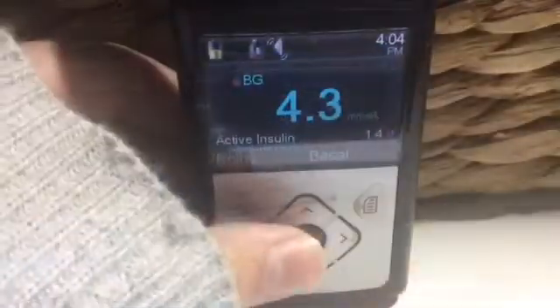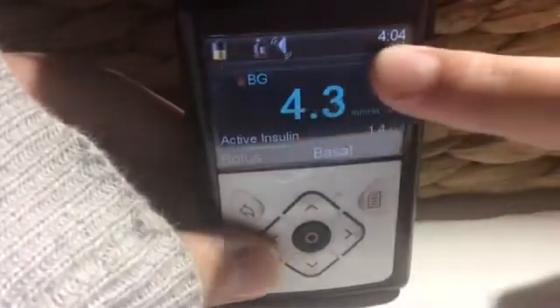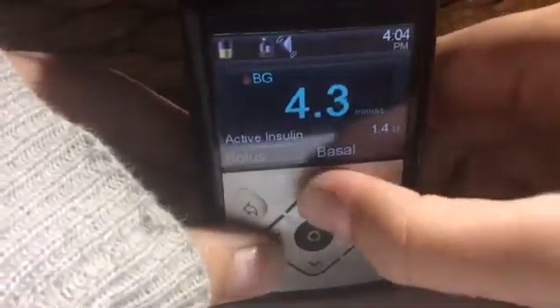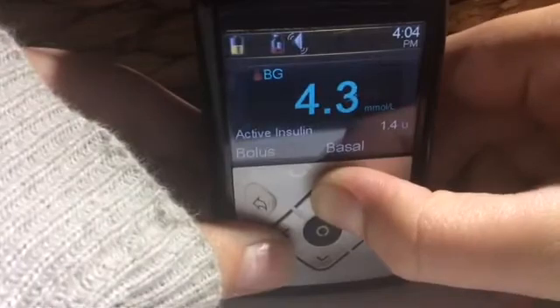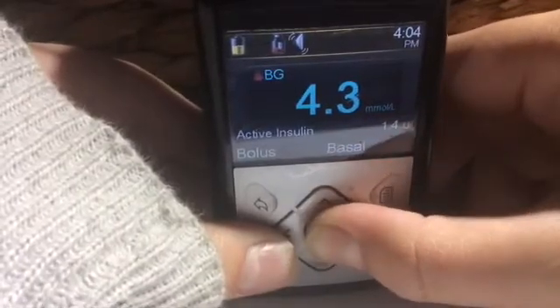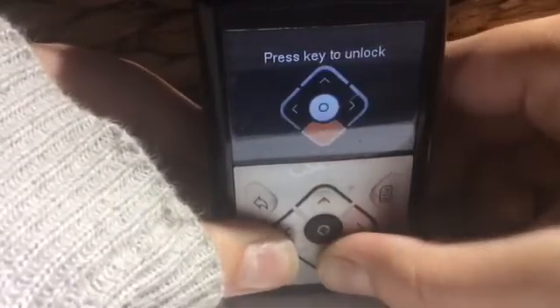Last but not least, this top bar up here. This bar shows you everything you might need to know. Again, I have another video for that which you can go check out now.